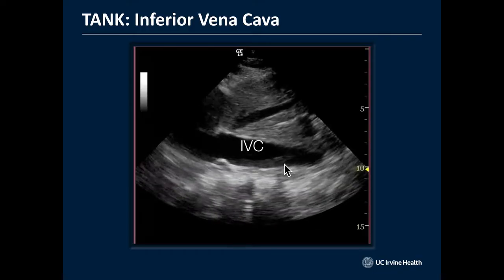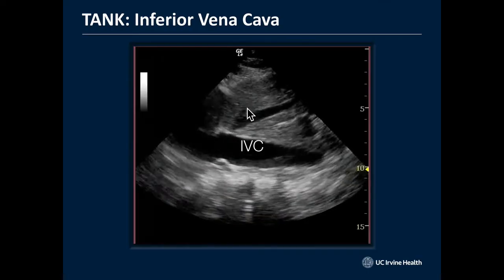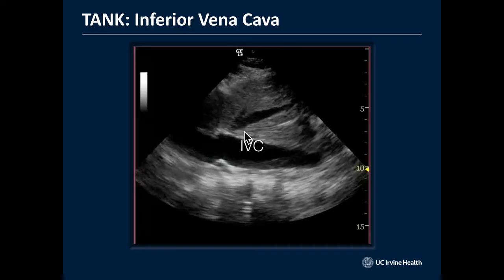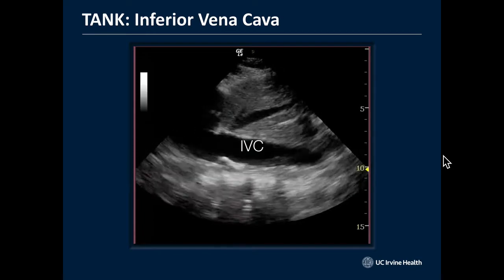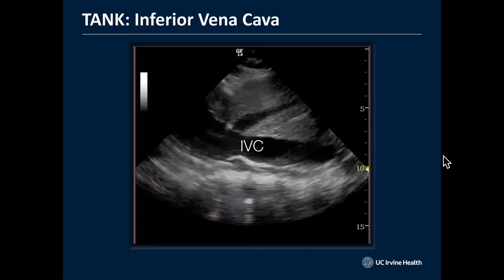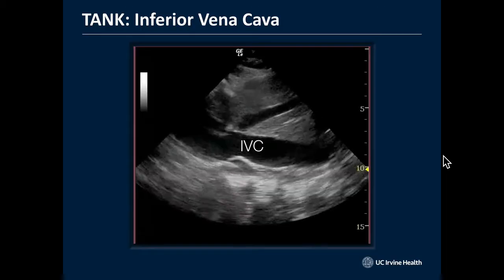With EPSS, you already know what's going on and whether they're at risk for congestive heart failure. So if you had a positive EPSS and then saw this plump IVC and this giant hepatic vein, you'd say, this patient has way too much fluid on board. We need to diurese, give them Lasix, and reduce their preload because they are in fluid overload. And the lungs can help you with that too, in a separate way.